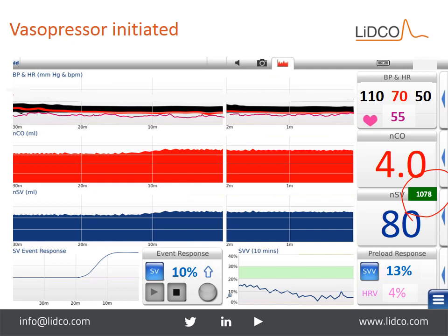But this is a young guy, healthy kid, and you can see his heart obviously is healthy, and it's coming up very nicely. His stroke volume didn't increase all that much. However, bottom line, his cardiac output went up with his heart rate coming up, and his blood pressure is a bit better. Stroke volume variation still remains at 13%, which is fine, but we're really interested in looking at the whole picture globally, making sure that we are increasing his perfusion to buy him time for the shock to run its course and work him up for any other subsequent injuries he could have sustained.